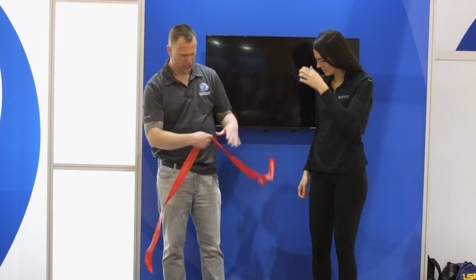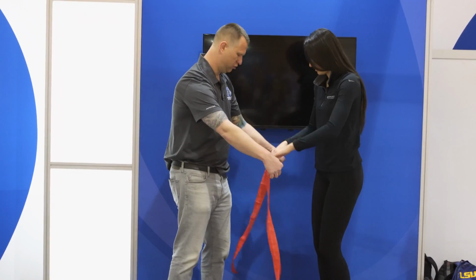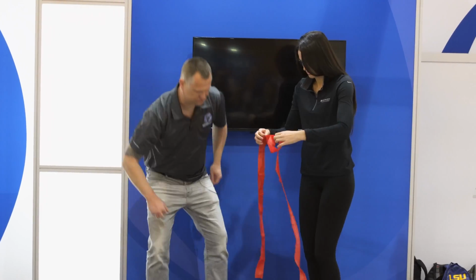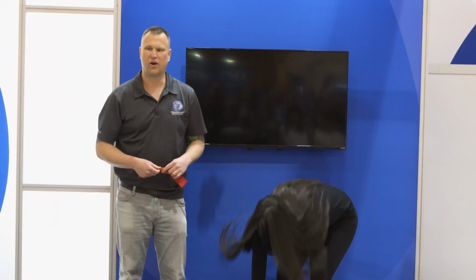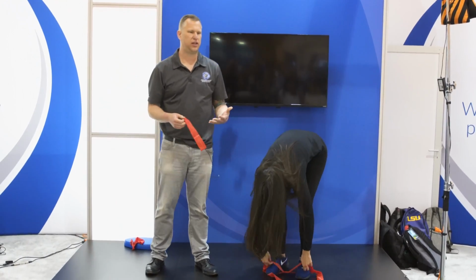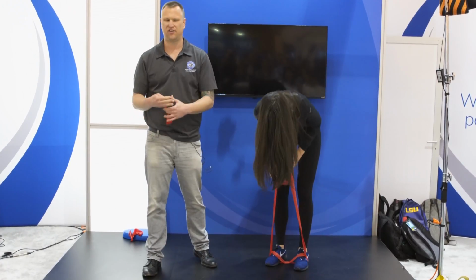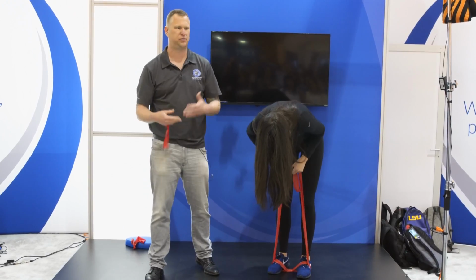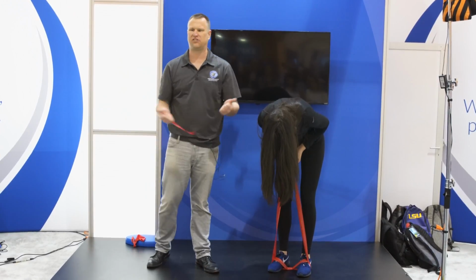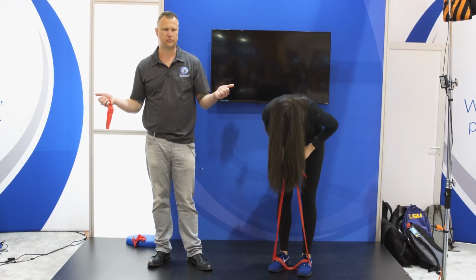All right, I'm gonna ask Becca, can we put one, center 2 loops on your feet? And then let's cross it with your hands. So what I've asked her to do, and I would teach this in the clinic, is to slip essentially the center of a standard band through the 2 feet. Nice and easy, you're not tying loops and so forth. Then she's gonna cross the bands to the opposite side, okay?